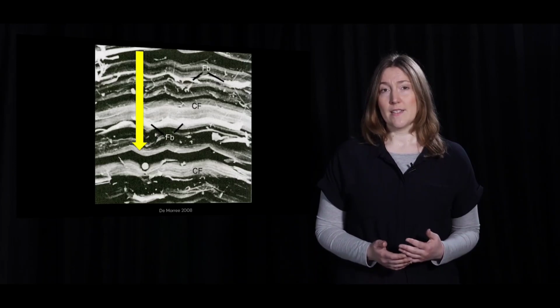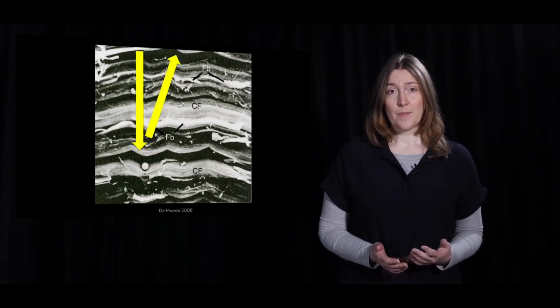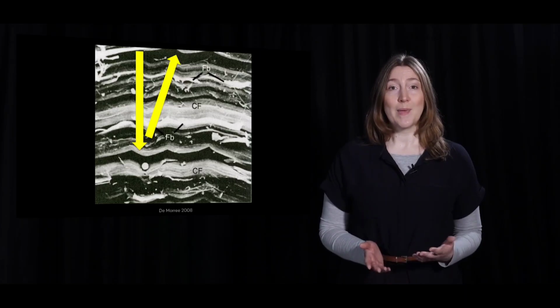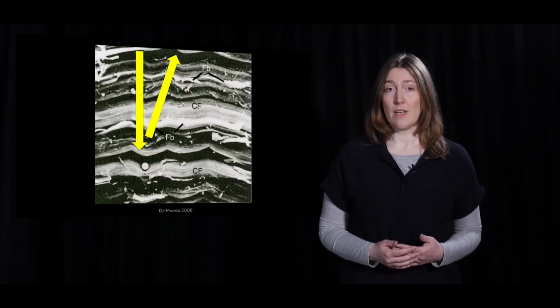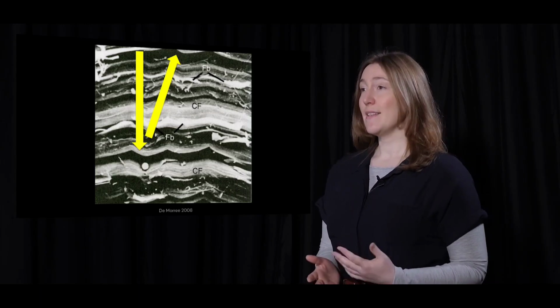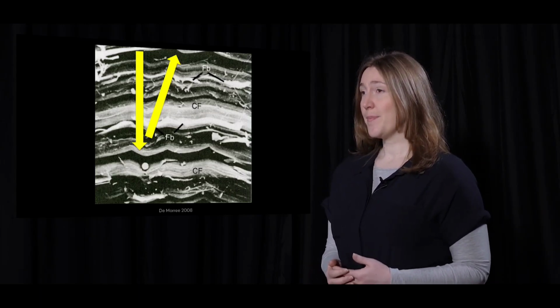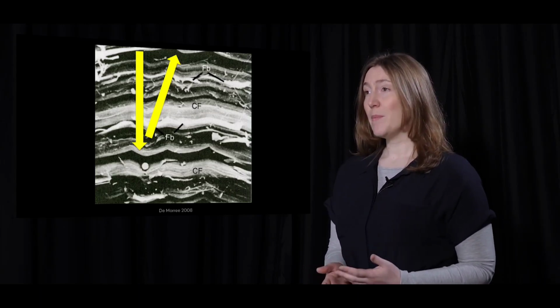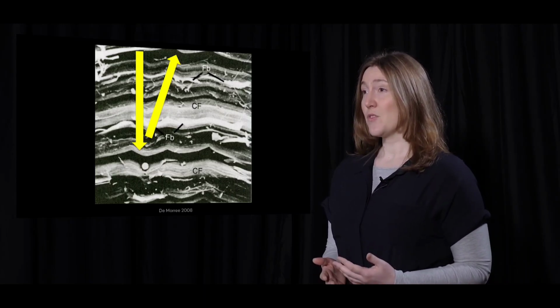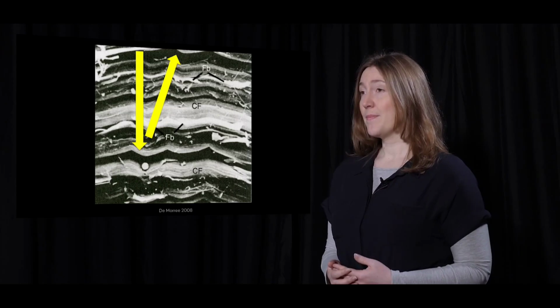The angle of incidence is the same as the angle of reflection. As a result, anisotropy on micro level can occur, which means that tendons are not correctly visualised. To avoid this anisotropy in tendons, we always scan tendons with a little bit of stretch. With this stretch, the wavy appearance of the tendon fibres will be straightened, and a perpendicular ultrasound scan is guaranteed.